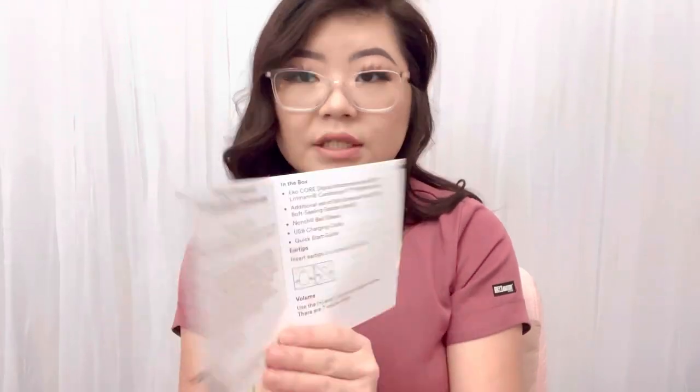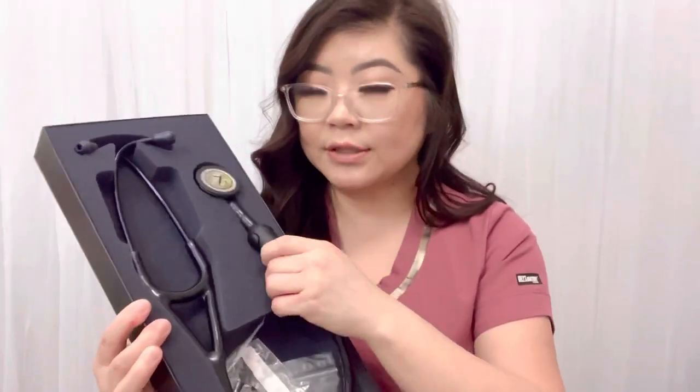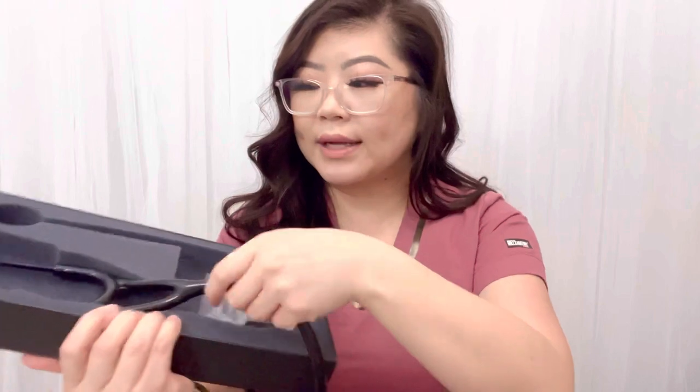This is the little booklet that comes with it. I haven't had a chance to read over it, but it shows you how to connect to the ECO software and gives you a quick guide on how to work your stethoscope. According to the manual, the stethoscope I got was a Cardiology 4, and the only difference is that it has the ECO Core digital attachment right here. So it's a Cardiology 4 stethoscope with the ECO software where you're able to record the sounds and listen to them later.